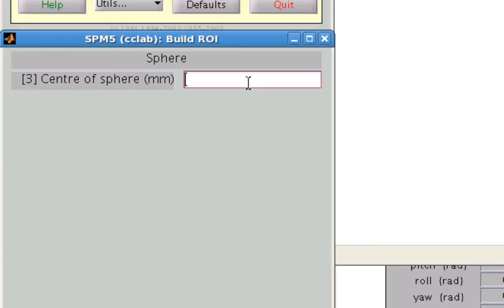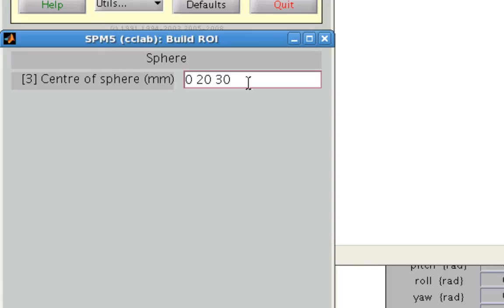Now the first argument that it wants is a triplet of coordinates in the x, y, and z directions for where this sphere should be centered. So in this case, I'm going to say it's 0 in the x direction, 20 in the y direction, and let's say 30 in the z direction. Again, these are in MNI coordinates.